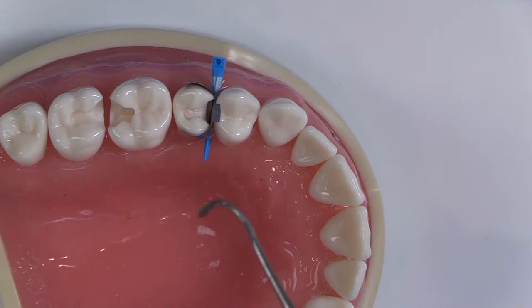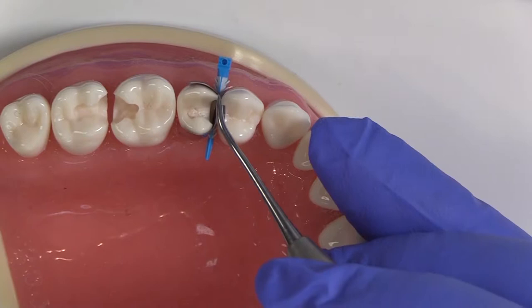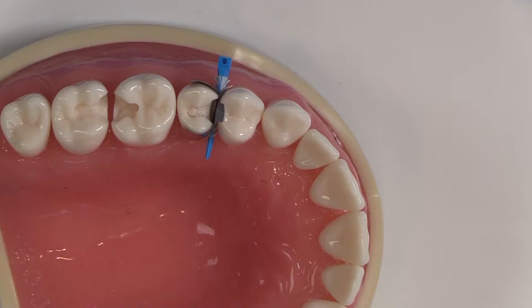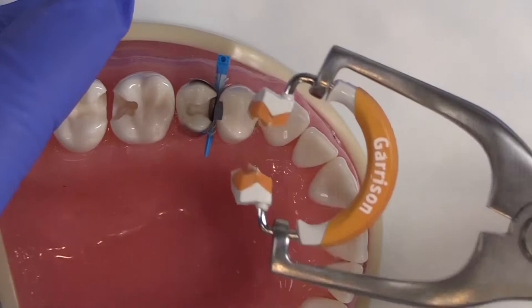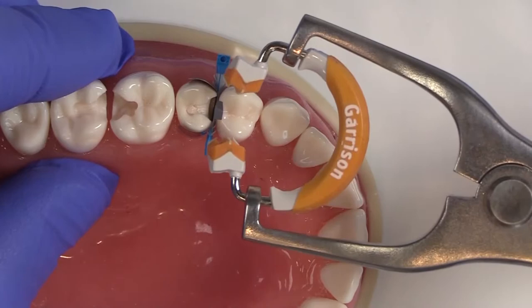I like to bend the matrix band over — this prevents a lot of material from getting in there and causing difficulty with finishing. Now we're going to place the tall 3D ring, and I like to have it facing towards the mesial. It's the easiest for insertion. I often have the rubber dam clamp over here and don't want to be going in the same direction, so I come right in and seat the ring pushing towards the matrix band.